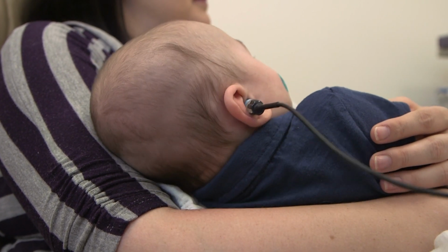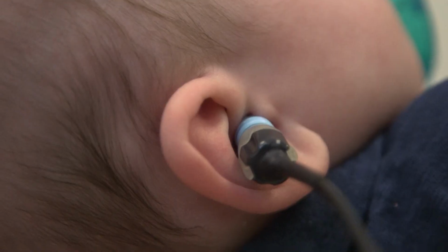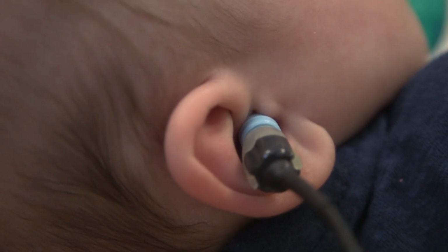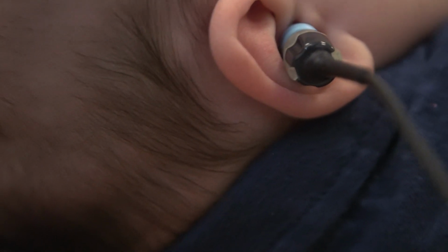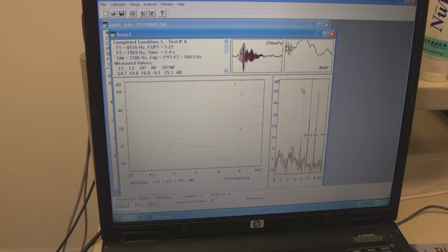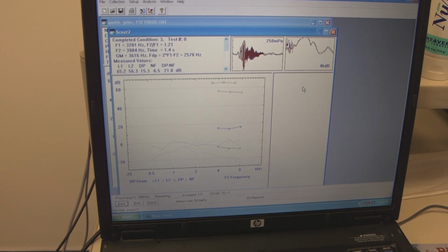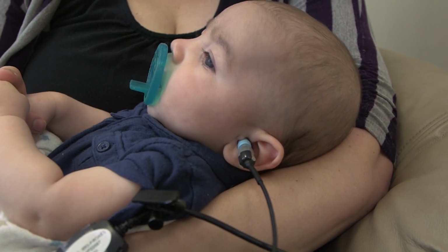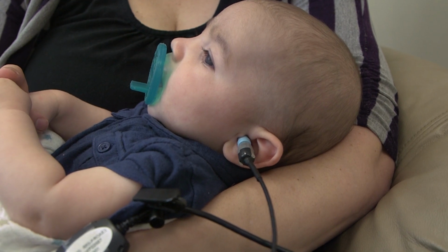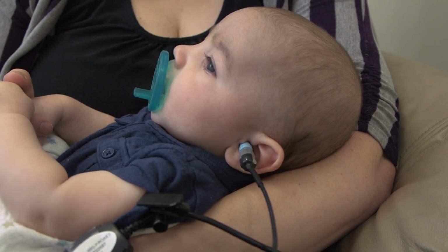For the OAE, or otoacoustic emission, we put a small ear probe in the baby's ear canal and then play a sound, and the ear sends back an echo. That test in a sleeping infant can take less than a minute. And we test each ear. It's important to know how hearing is in both ears. So if the baby passes that test, we wouldn't necessarily recommend another test unless there were certain what we call risk factors for developing hearing loss later in life.